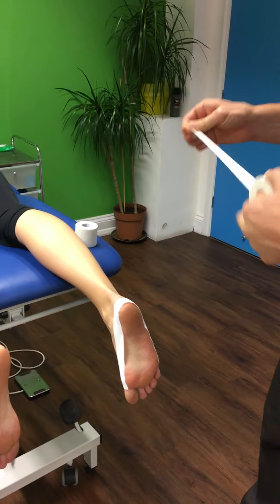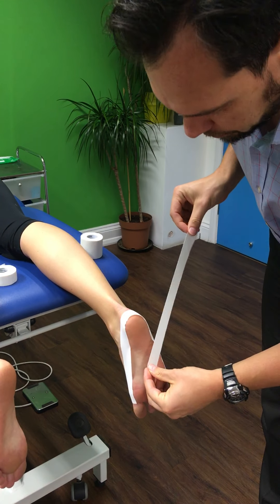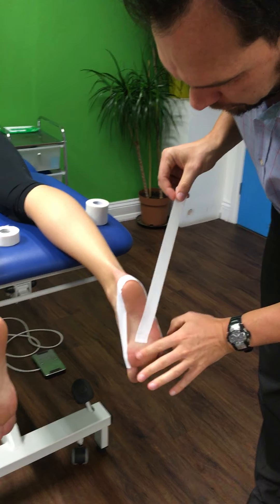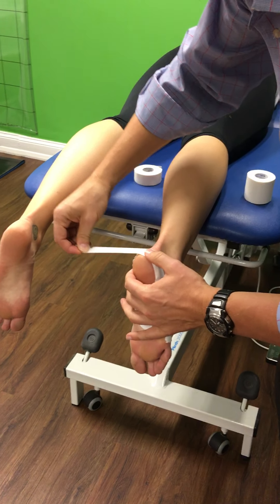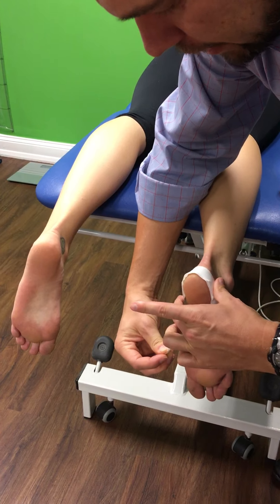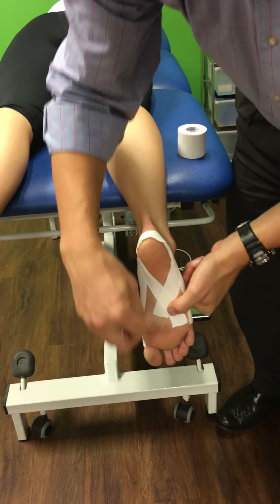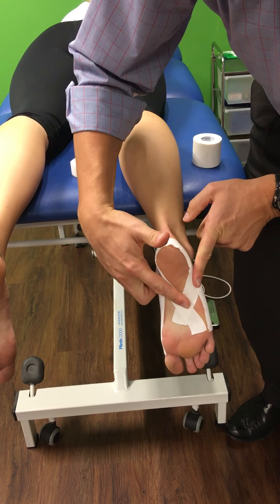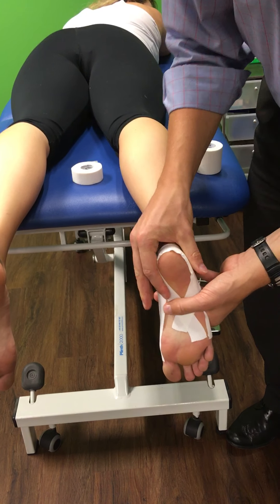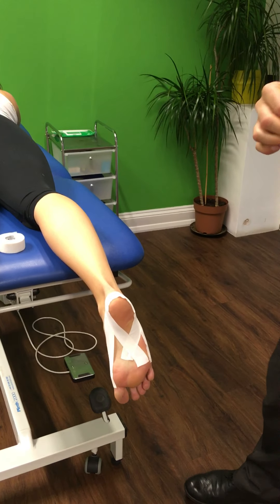The next strip is about the same length using the thinner tape. This time we're going to do something called a heel lock. We start around the middle of the foot, bring the tape around — it will ruffle up a little bit, don't worry about that. As we get to the heel we apply a bit of tension and then cross over, so it looks a bit like a charity ribbon. We're just putting a little bit of pressure to hold that heel in.